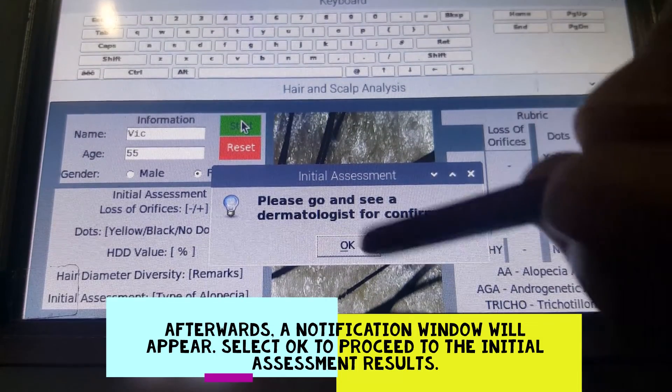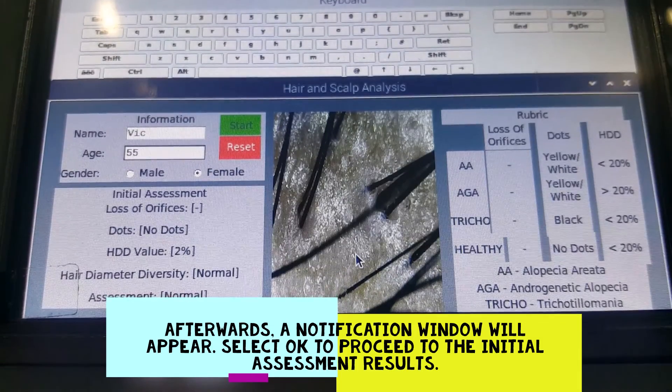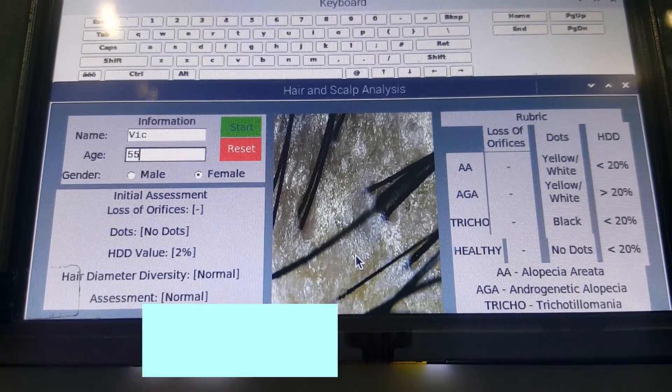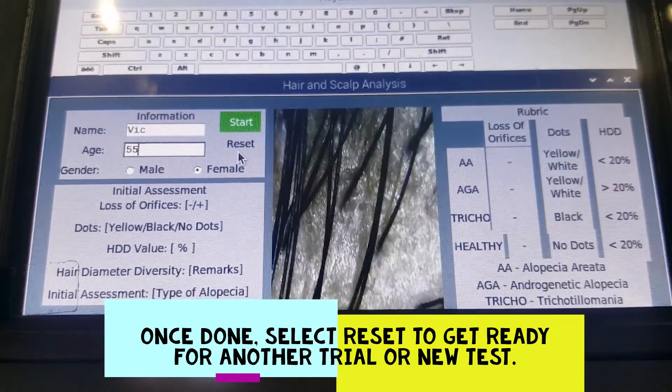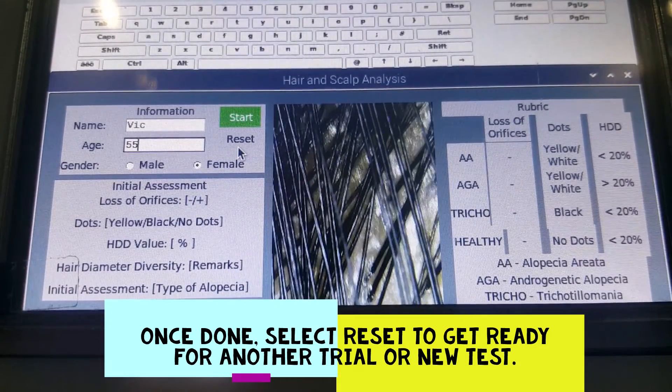Afterwards, a notification window will appear. Select OK to proceed to the initial assessment results. Once done, select Reset to get ready for another trial or a new test.